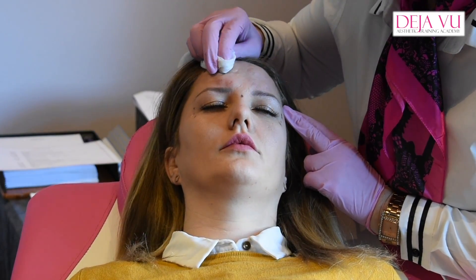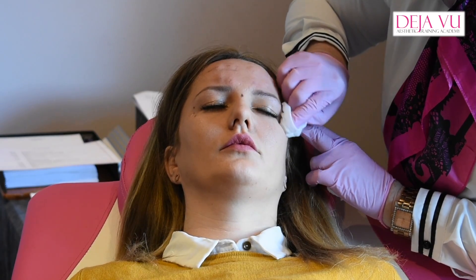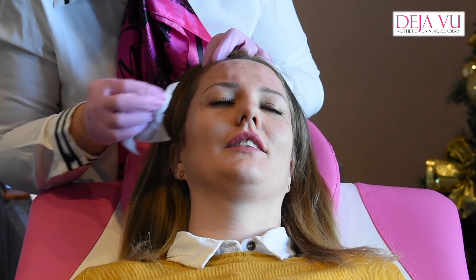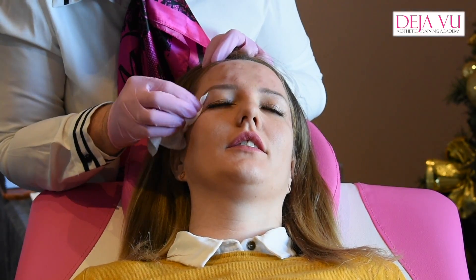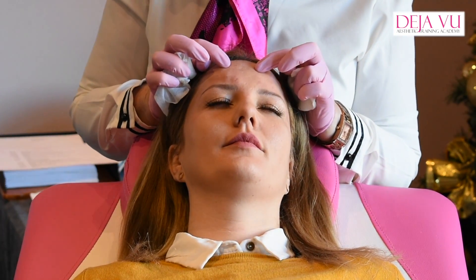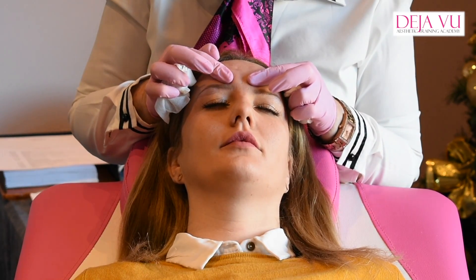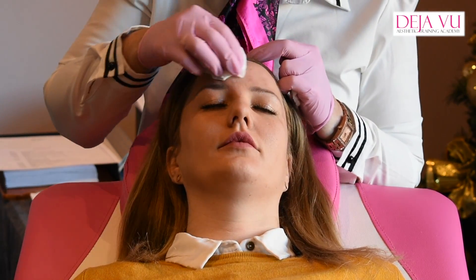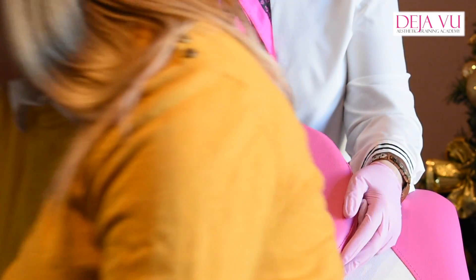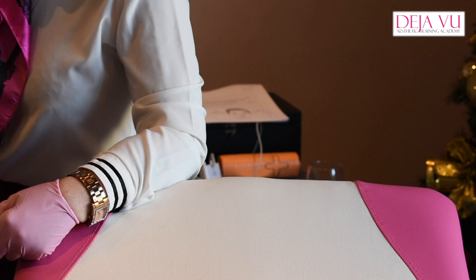Just try not to rub too much — dot, if anything. If you've got any little bumps there, you can just press them down. If they're going out anywhere special, bear that in mind. Is there any questions from anybody on that one?